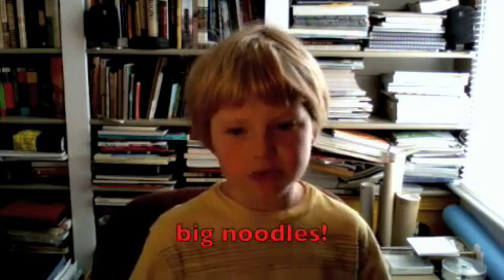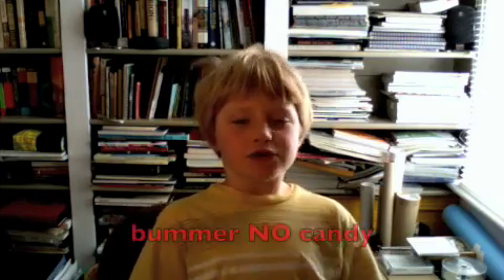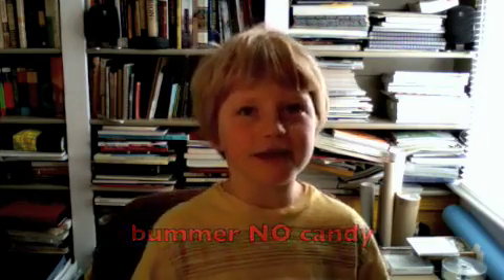It's so hard for me to talk. Food gets stuck up there a lot. There's a lot of things you can't eat. It says be careful with big noodles, don't eat caramel, don't eat suckers. There's a lot of candies you can't eat. No bagels.